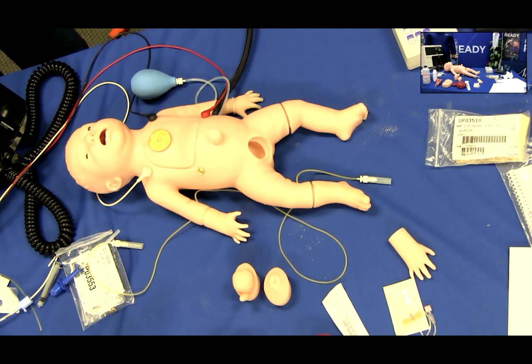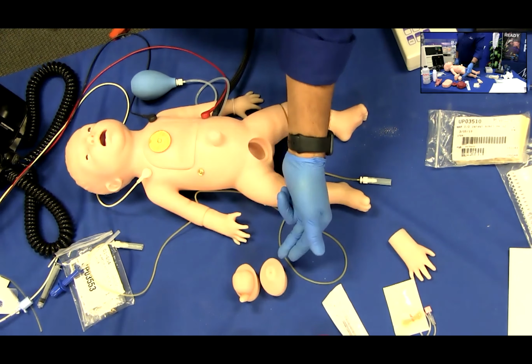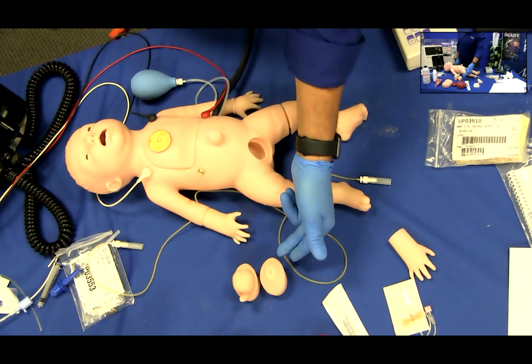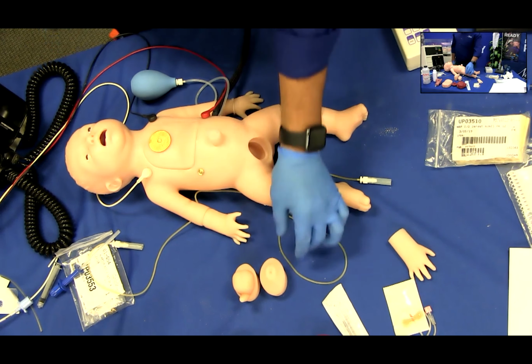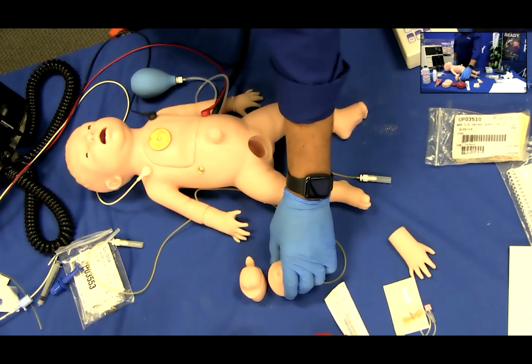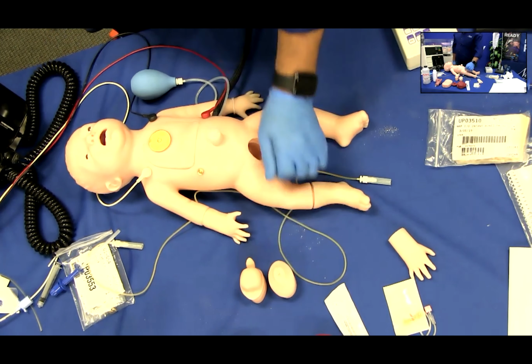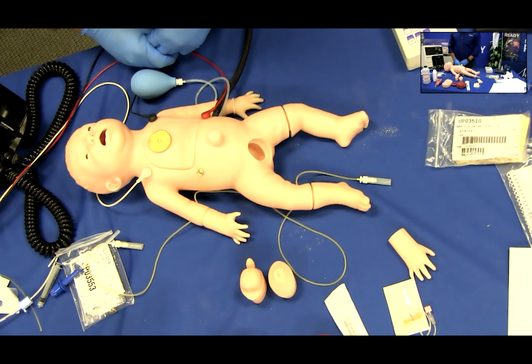Genitals. The male and female genital inserts may be used interchangeably. The genital inserts are for catheter placement practice and not designed to deliver fluids. The anal opening may be used for the administration of rectal medications in suppository form. Do not attempt to infuse fluids.